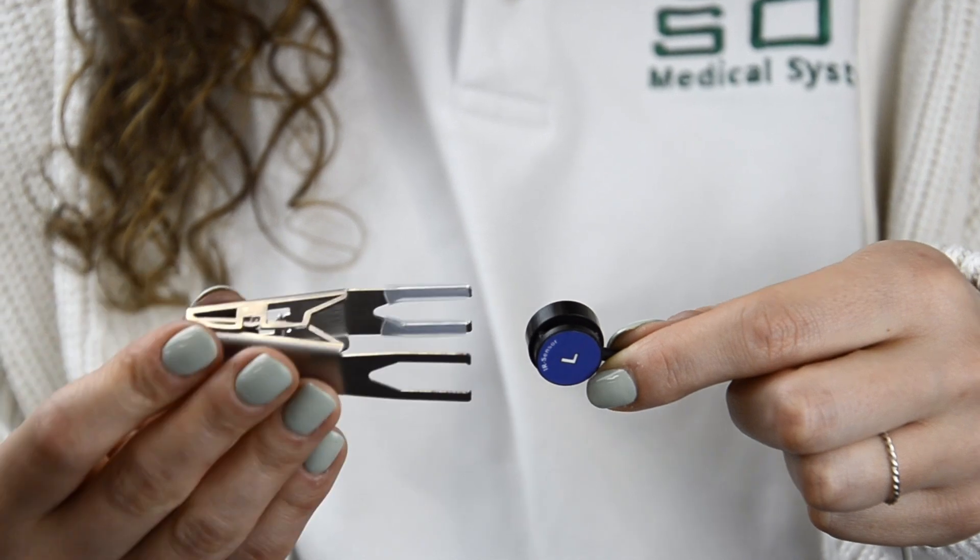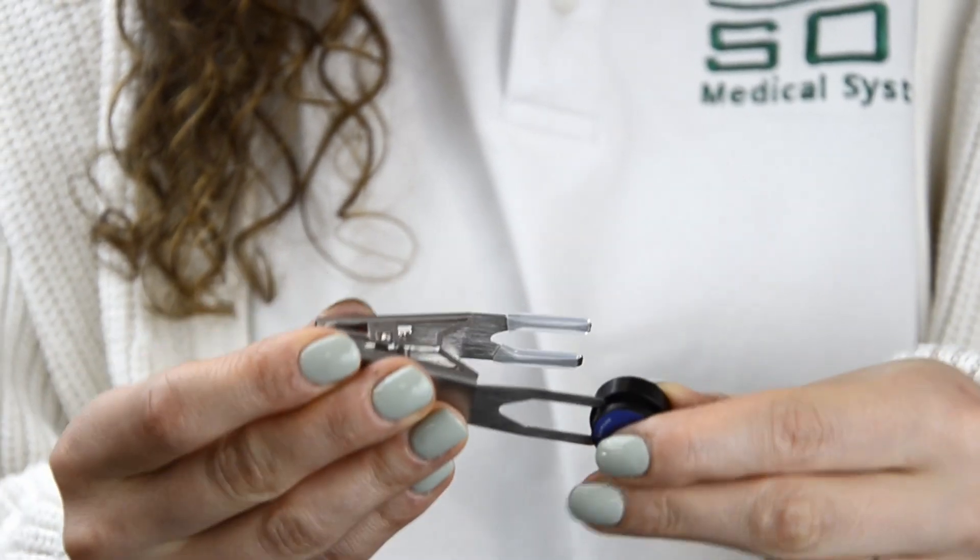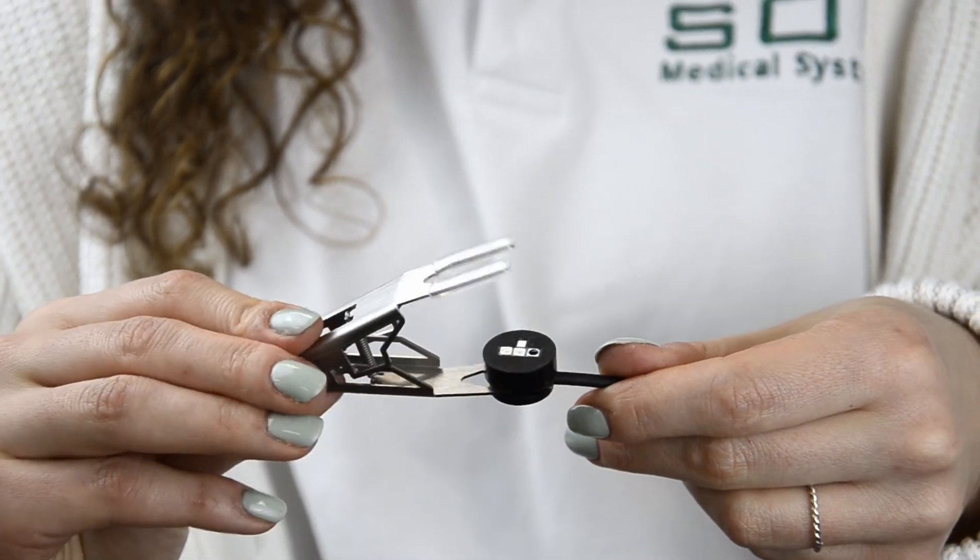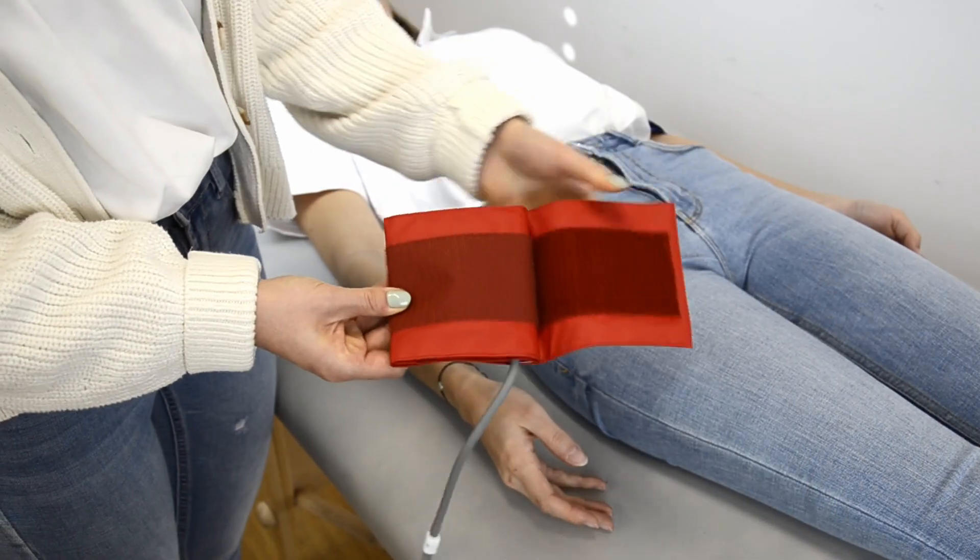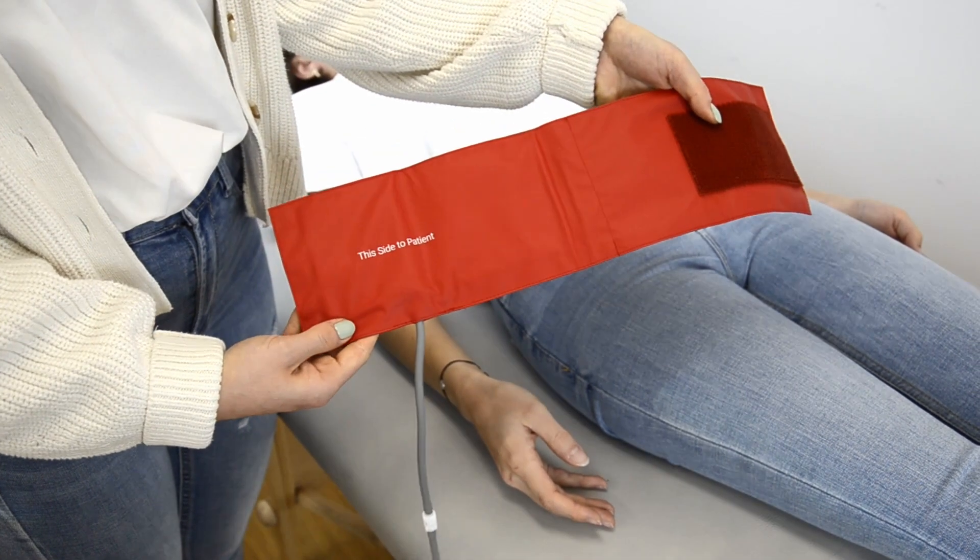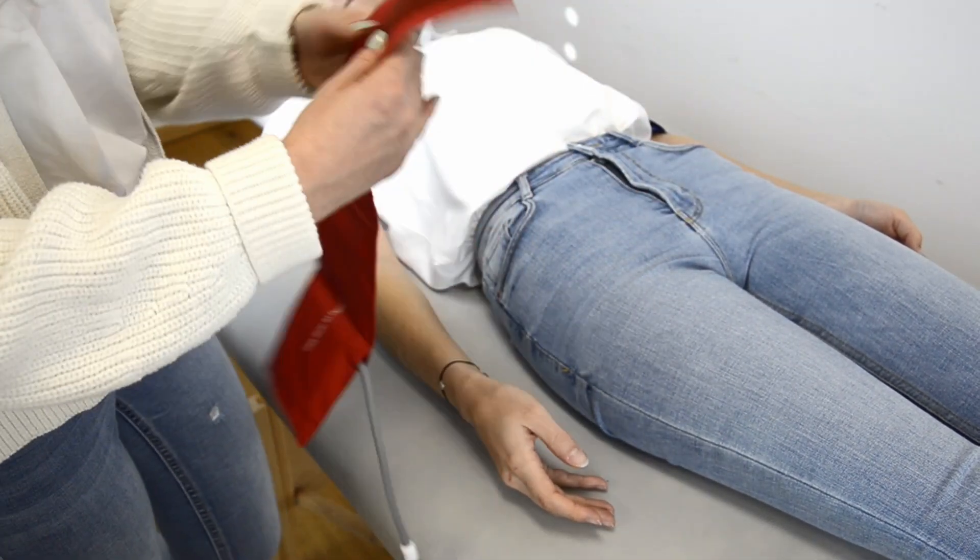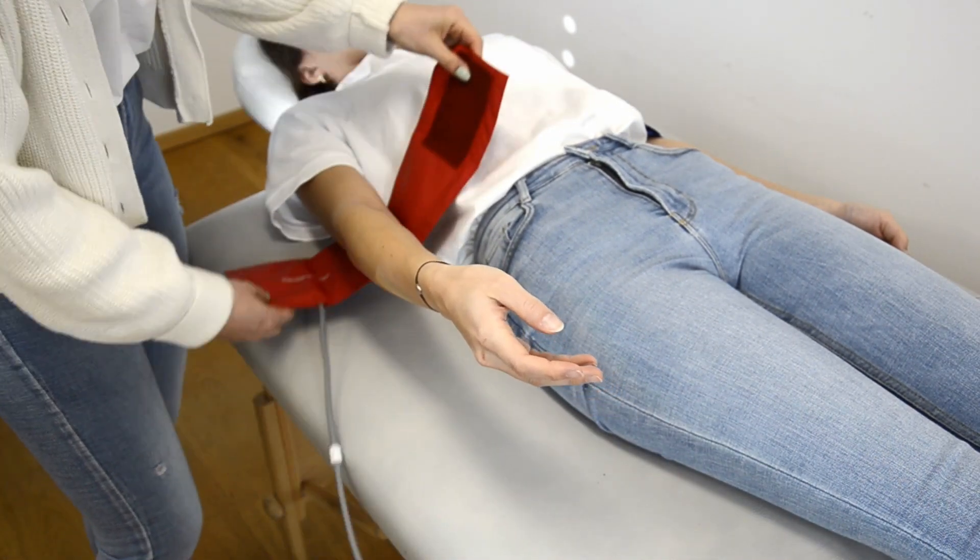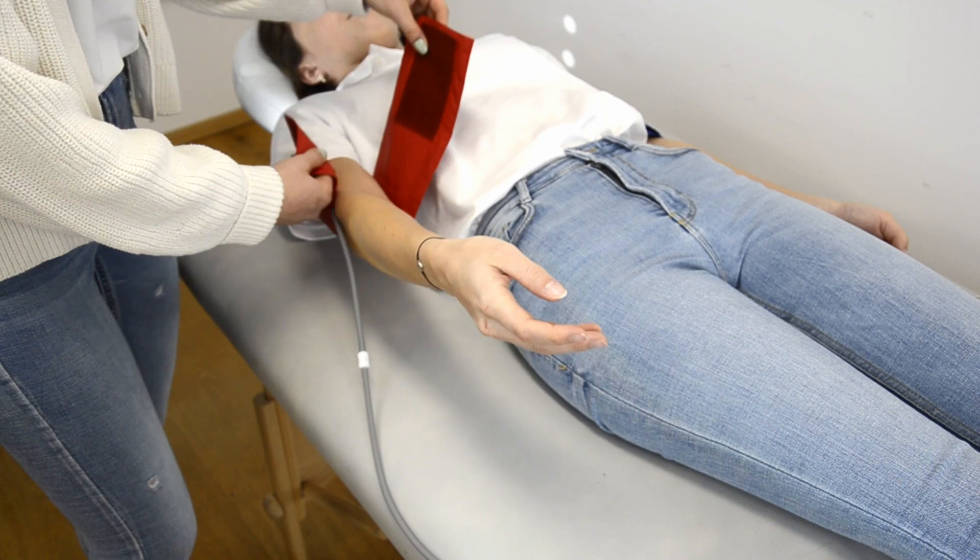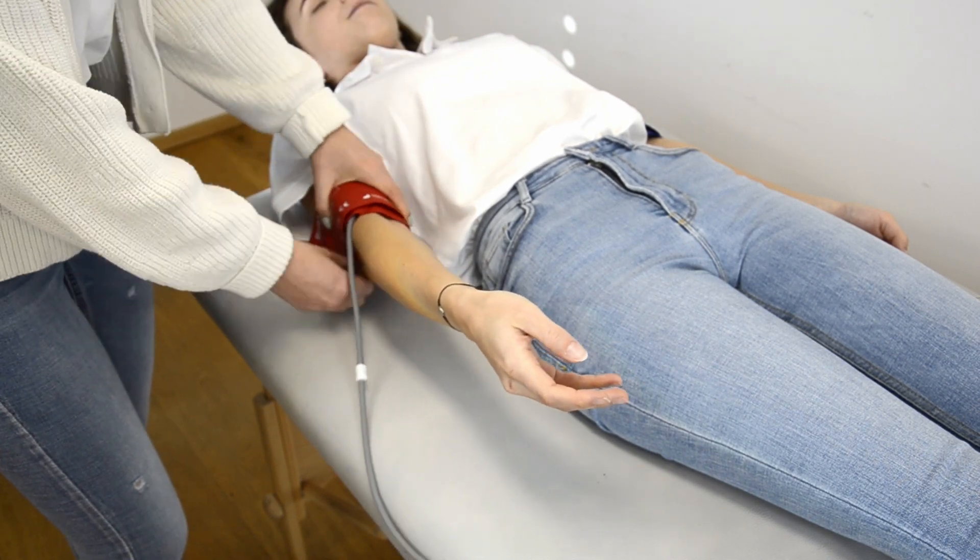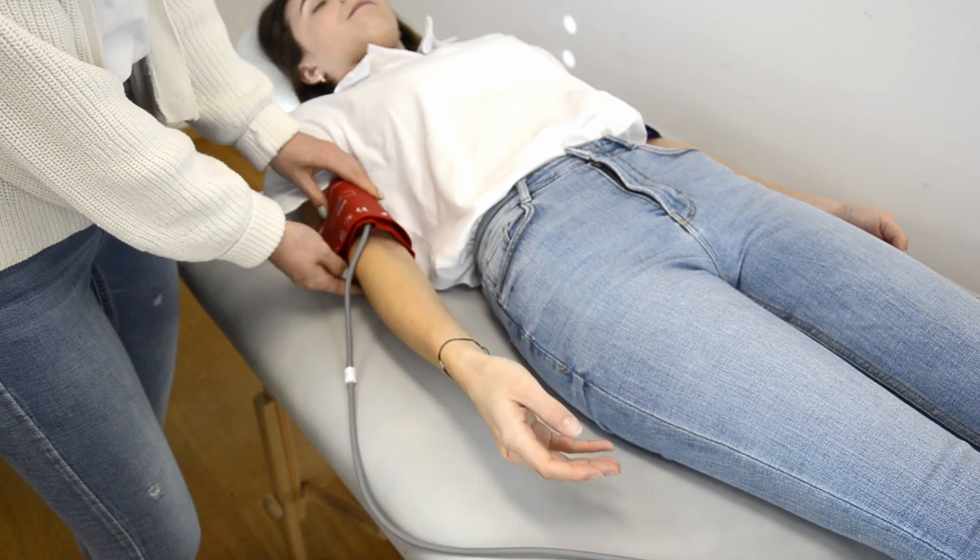Attach the metal clips to the sensors. Be sure that the orientation of the sensor is correct. Apply the upper arm cuff as indicated in the video. Make sure to select the correct size of the cuff, choosing between small or medium cuffs depending on the circumference of the upper arm. Make sure that the cuffs are equally tight placed on the left and the right side of the body.